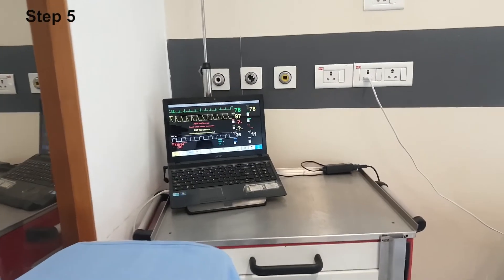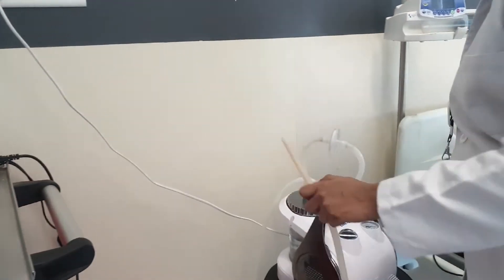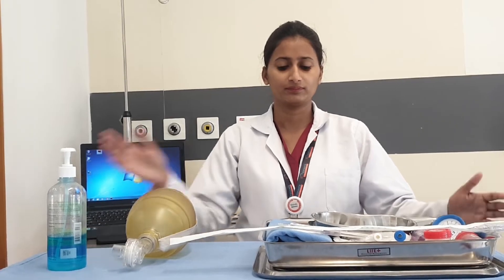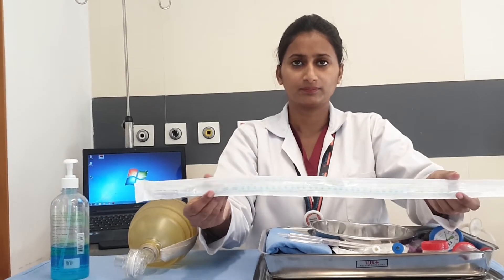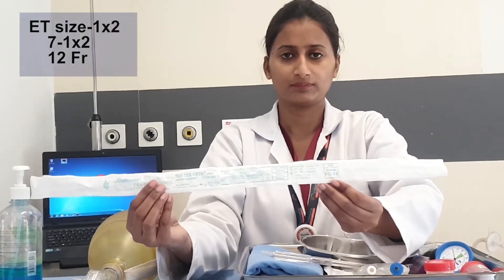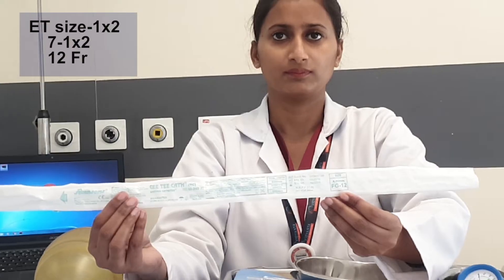Check the vital parameters and check the working of the suction apparatus. Arrange the articles. The tray contains an appropriate size suction catheter according to the patient's ET tube size. As the patient's ET size is 7, the suction catheter size will be 12 French, according to the formula: (ET size minus 1) multiplied by 2.